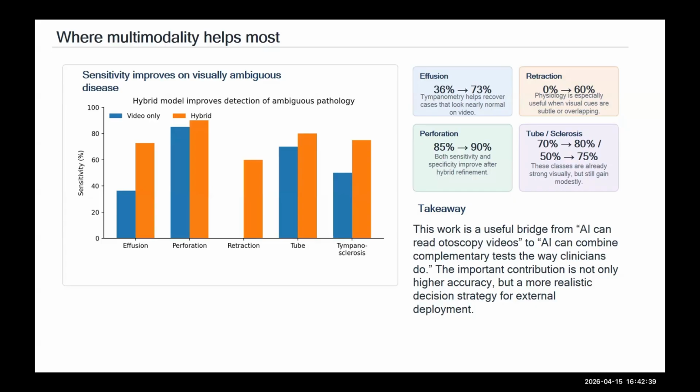Is there something on the front end that will help indicate poor quality data while the examination is happening? I presume the implication is perhaps you could prompt someone to provide better quality data if they understood they were doing something not perfectly. Oh, yes, yes.